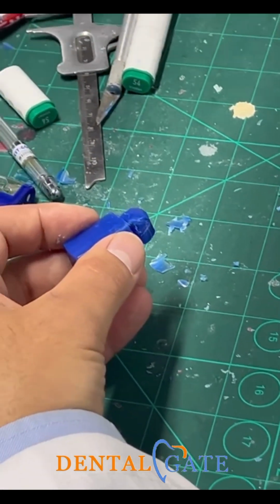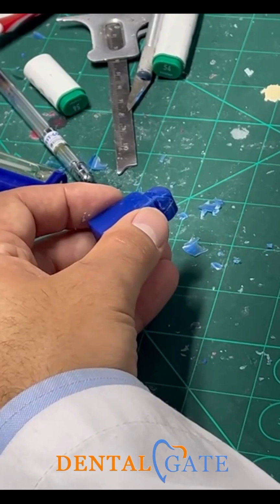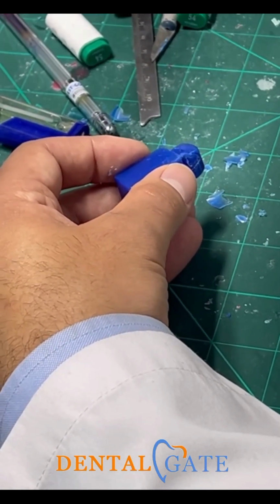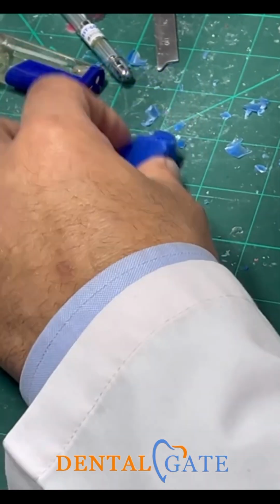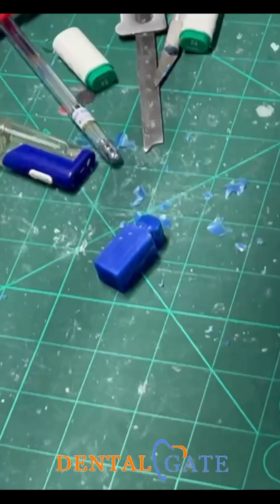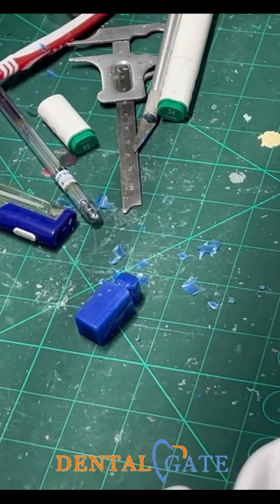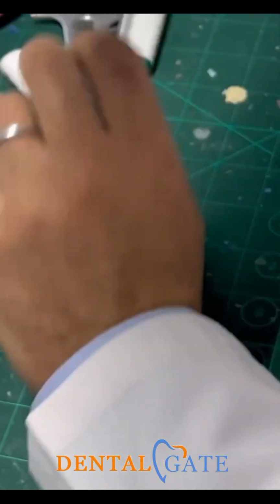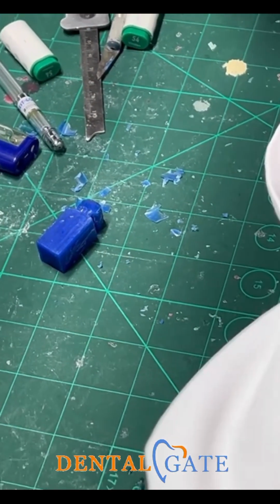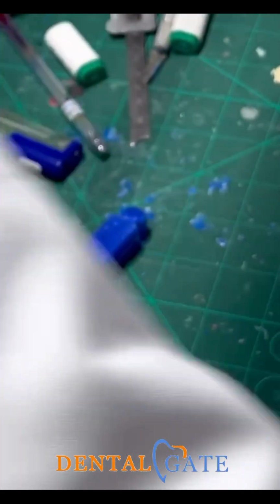If you want it without any aesthetic, you can make it a full anatomy, adding only stain. This is not the aesthetic one. The aesthetic one, I will start with the lateral, then the central. I will add another layering. It will be called a micro layering, because I will add more aesthetic to this feature. So I will put the marginal ridge individually. I will put the middle third individually.